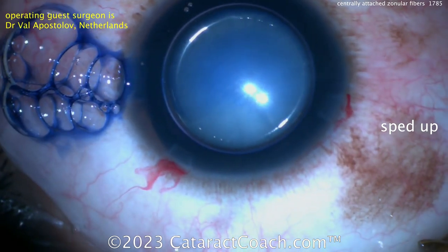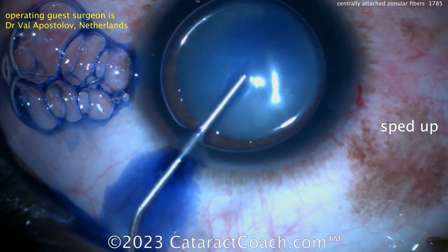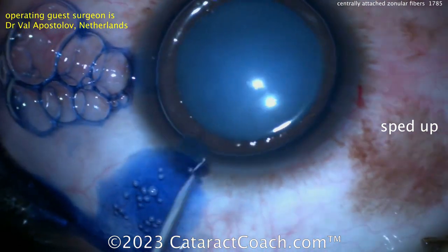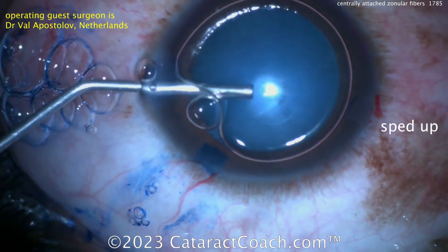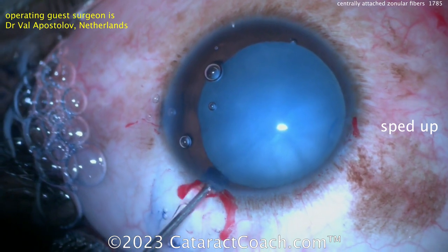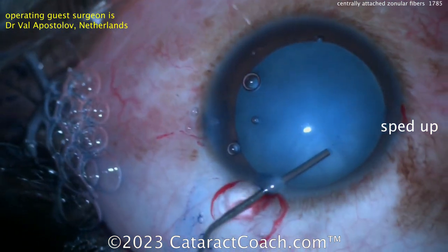You can see the trypan blue dye going in to stain the lens capsule. The patient has obviously a very white cataract, very opaque. Spreading out that dye a little bit here. Here comes the viscoelastic. And you can see, if you look very carefully, there are some zonular fibers there.